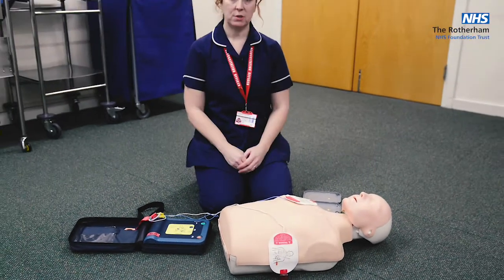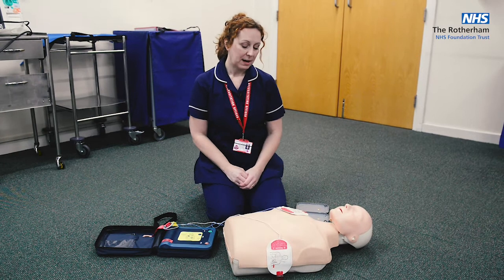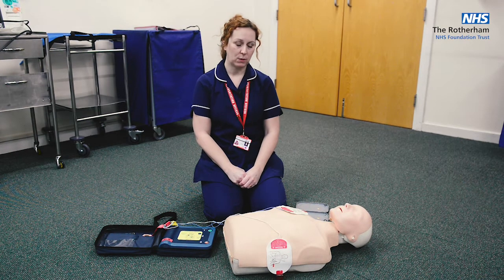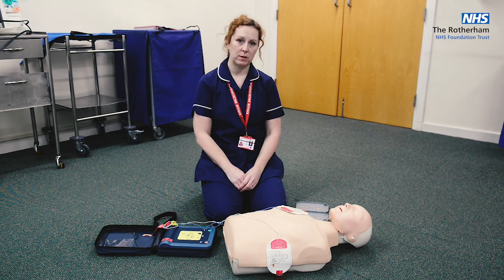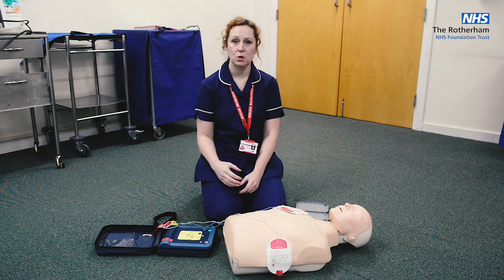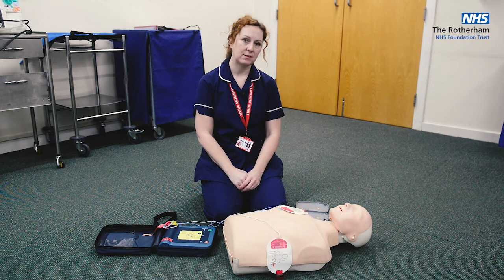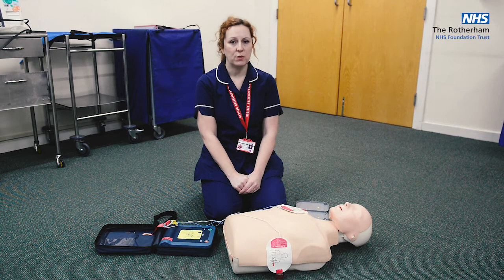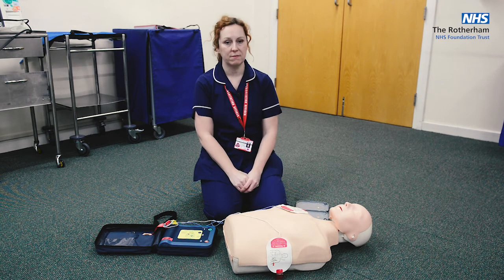It's really simple to use an AED, but there are a few things to keep in mind. The pads need to go onto clean, dry, bare skin. The patient will probably be wearing clothes — use the scissors available with your AED to cut them off. If the patient has a hairy chest, there should also be a razor available. You only need to shave strips where the pads sit, not the whole chest. If the patient has jewellery on, it's too fiddly to remove — just make sure it's not stuck under the pads and it will be fine.